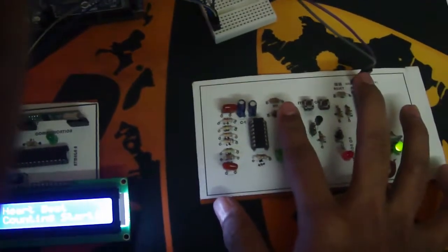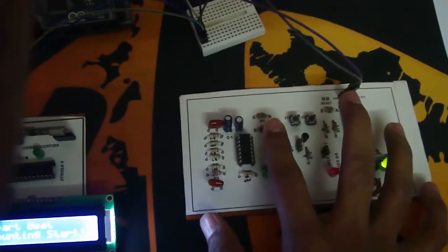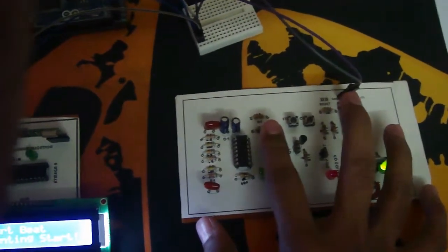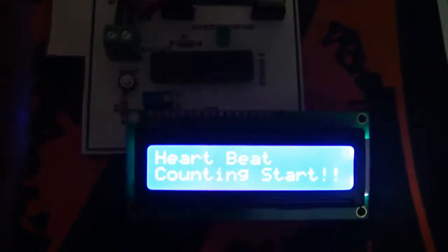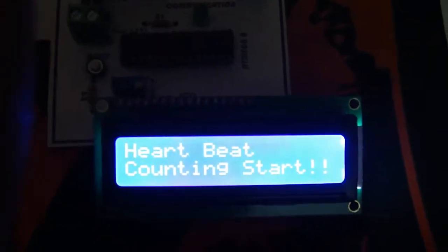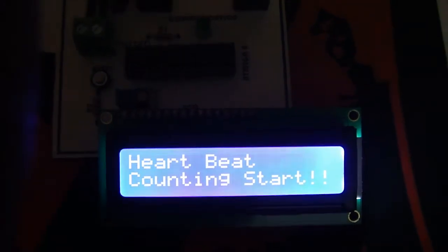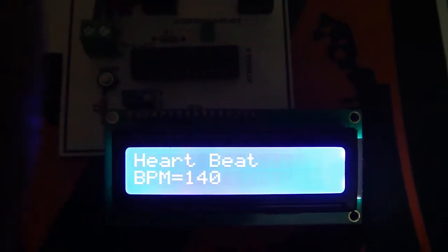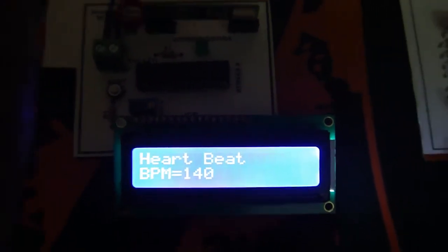Now it's taking the data and will send the BPM through RF transmission. You can see counting start, counting stopped, and the BPM is 140.